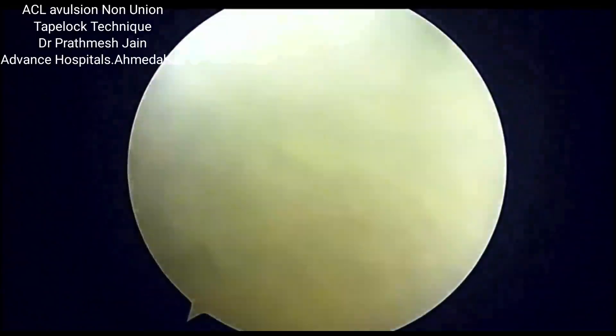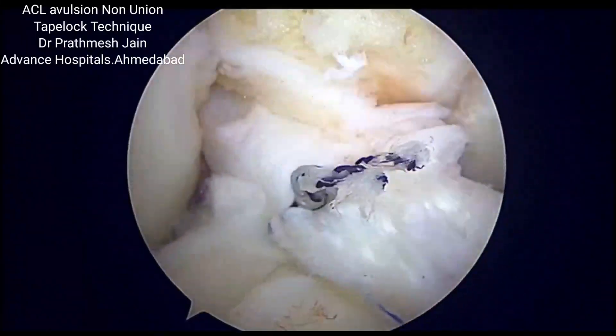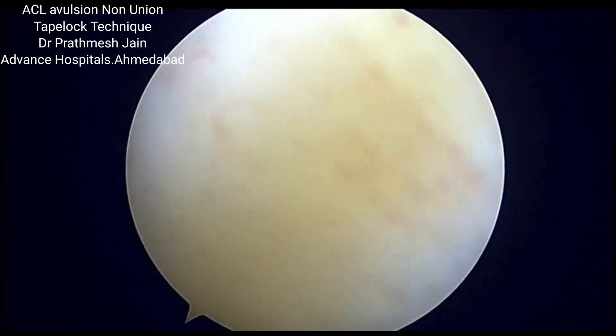This technique is a very good technique for a primary ACL avulsion as well.